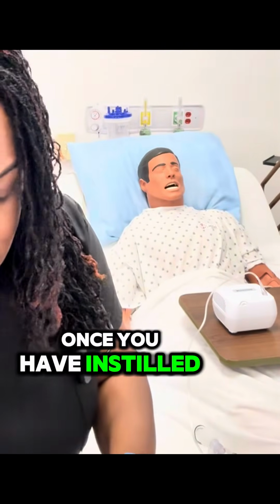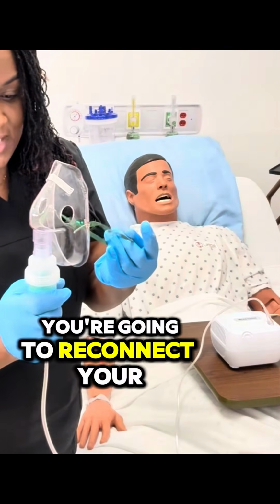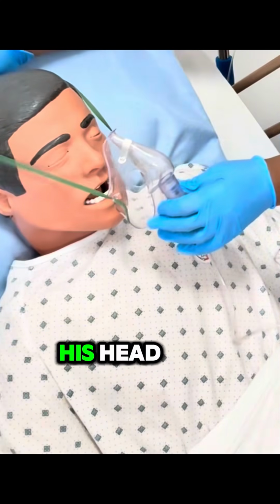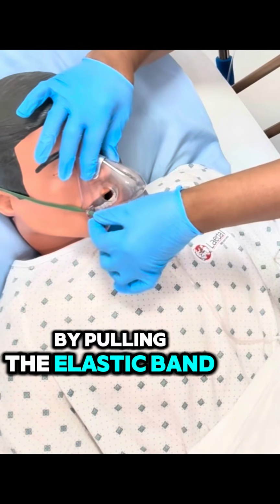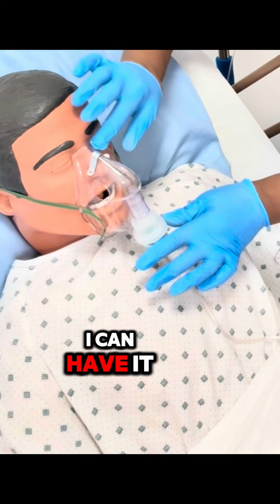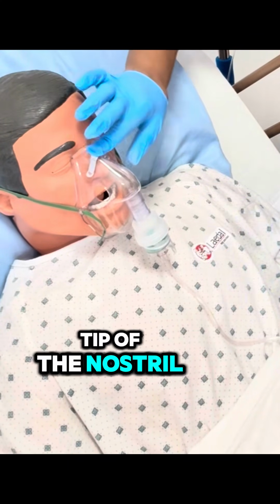Once you have instilled your medication, you're going to reconnect your mask, twist, and ask my patient to raise his head if he can do so. I can adjust the tightness of the mask by pulling the elastic band. There's also a little area here where if I pinch it, I can have it fit more to the face, and it's at the tip of the nostril.